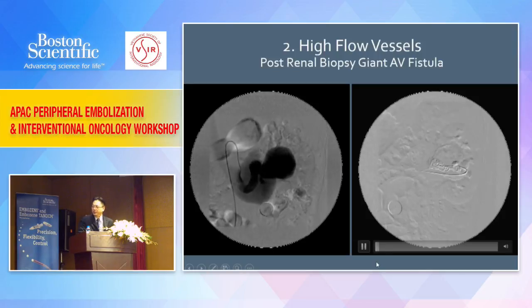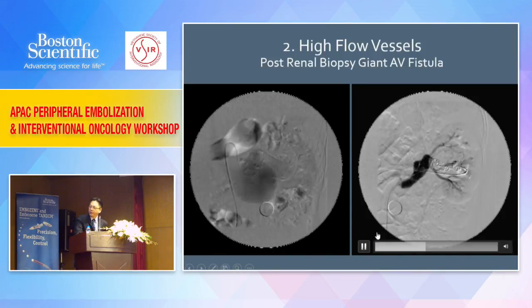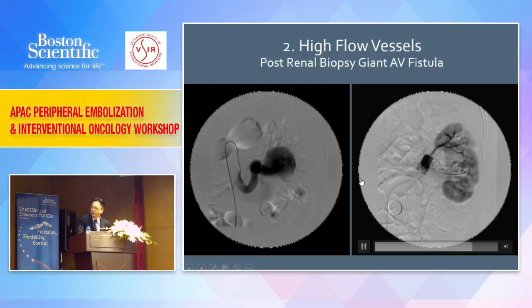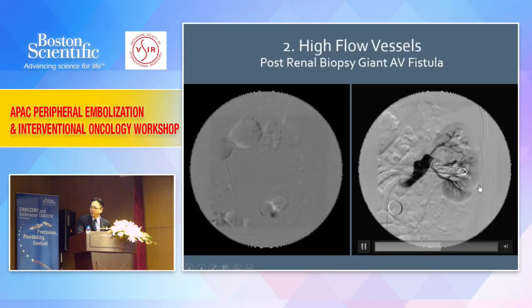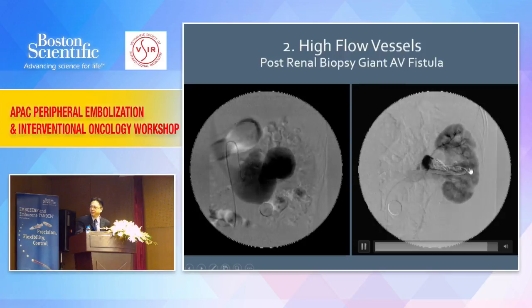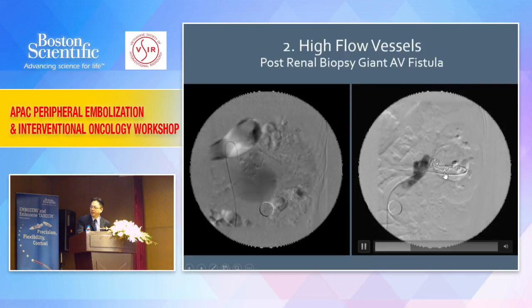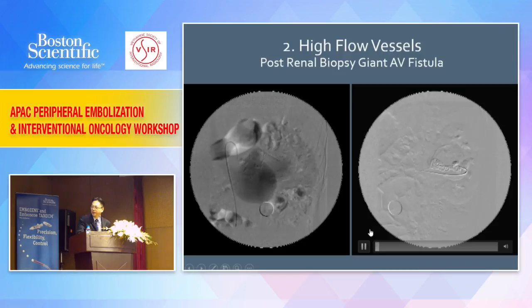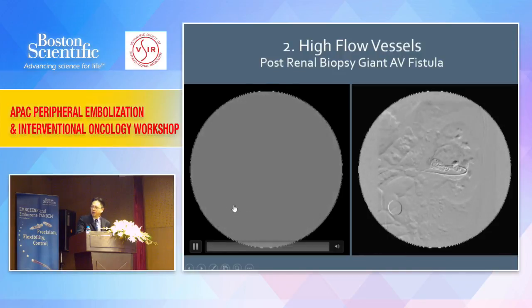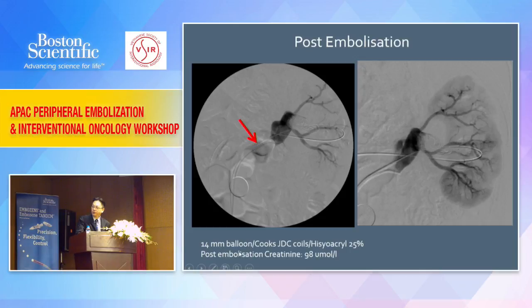Anyway, I just wanted to play safe. You see that I put a catheter in the venous side, in the renal vein, and another catheter in the arterial side. I wanted to have a very strong scaffolding device, okay? Then I actually had a guiding catheter at this end in case I needed to quickly shove a balloon out to protect it. And from the arterial side, we float a 14 mm balloon for flow control, inflow control, like the second patient. The IR also put a balloon proximally to try to control, but the balloon was too small, 14 mm.